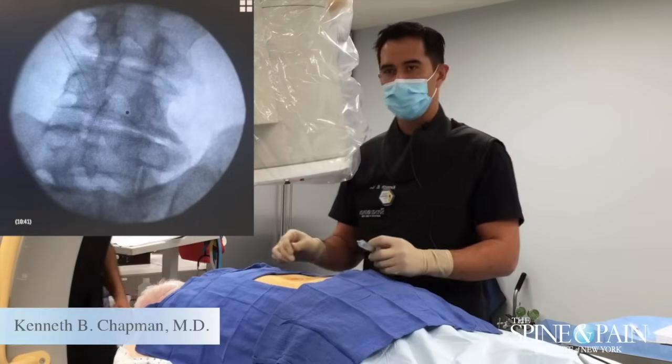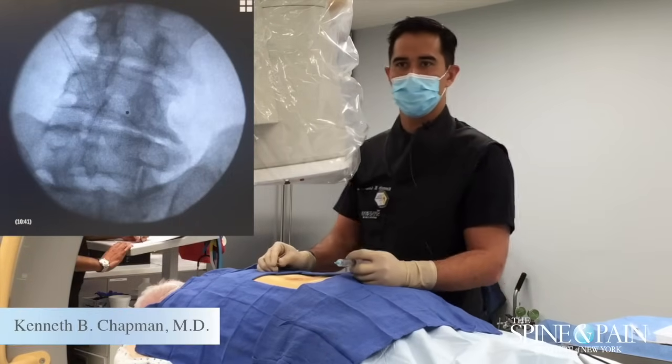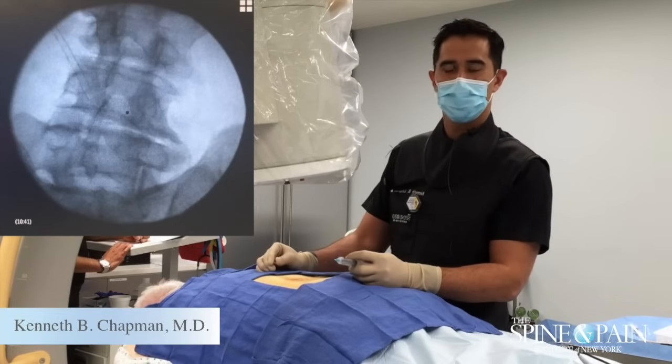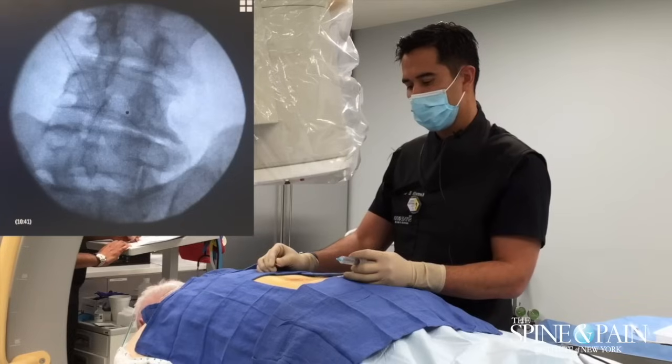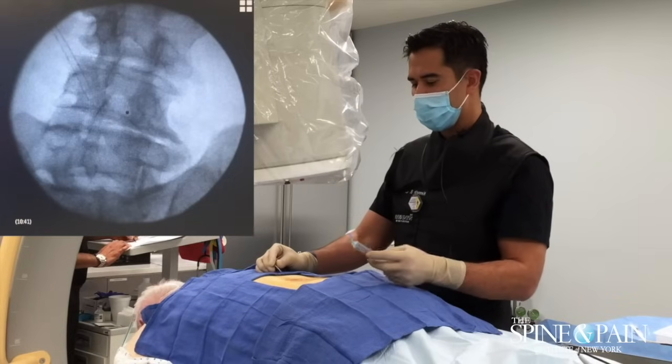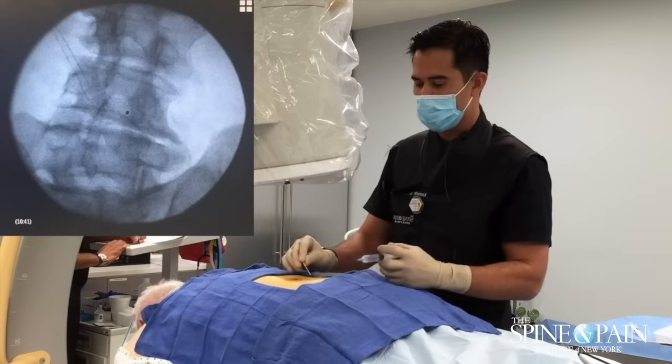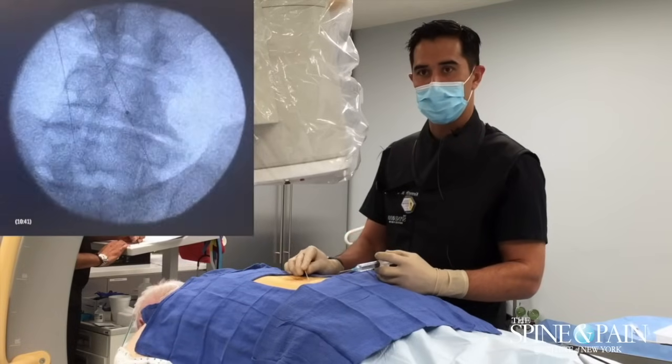This is a 77-year-old gentleman. We performed the radiofrequency ablation on the left side of his lumbar spine and he's been doing great so far with that. Now we're working on the right side. He had a block about two weeks ago and a positive response to the diagnostic portion of the injection, so we're going ahead with the radiofrequency today.